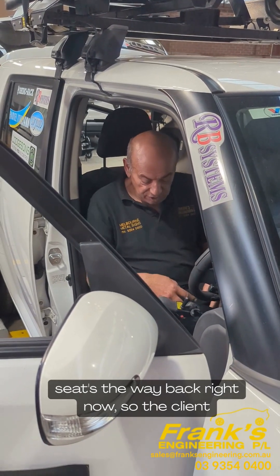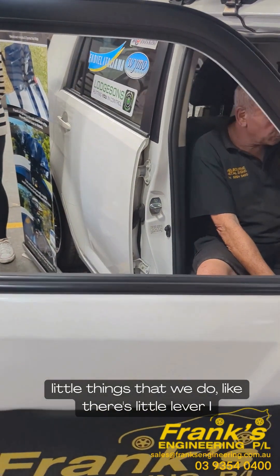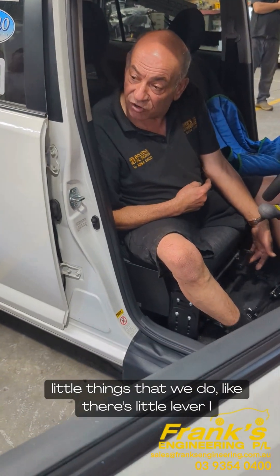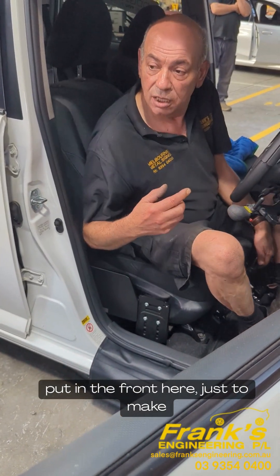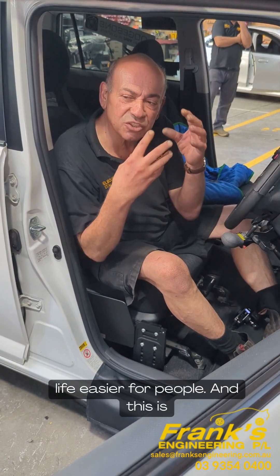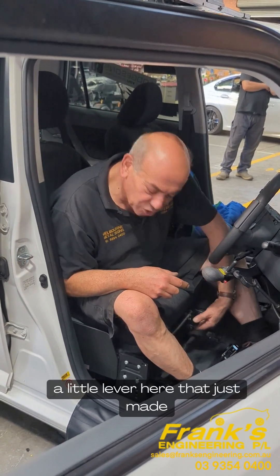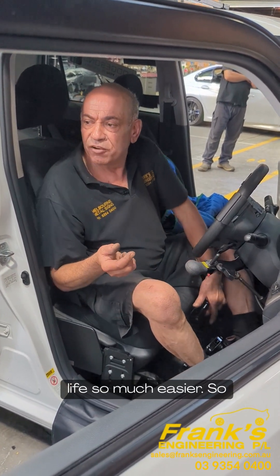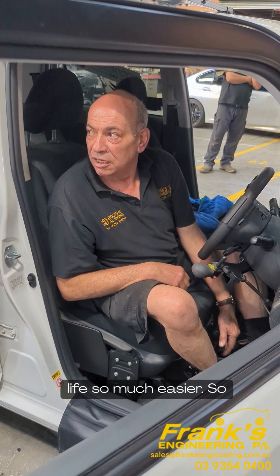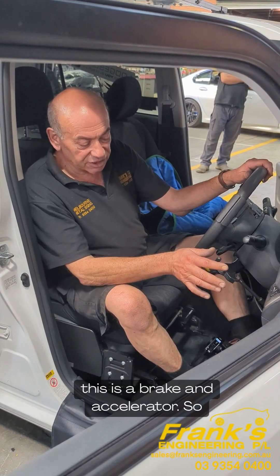The seat is all the way back right now so the client sometimes can't reach down here. There are little things we do, like there's a little lever I put in the front here, and this is where we assess the person. They might need just a little lever here — that just made life so much easier.